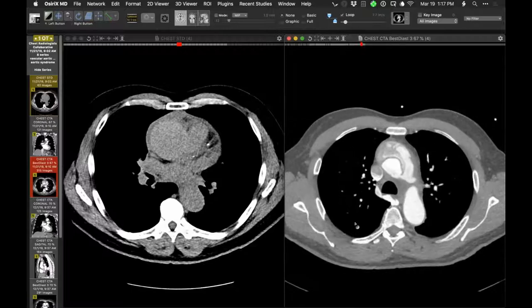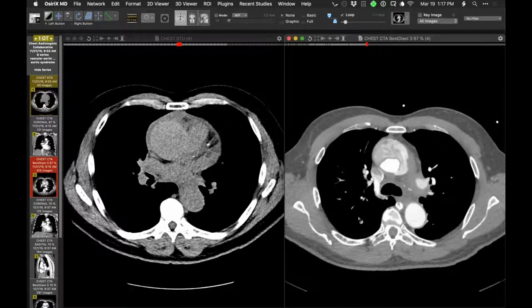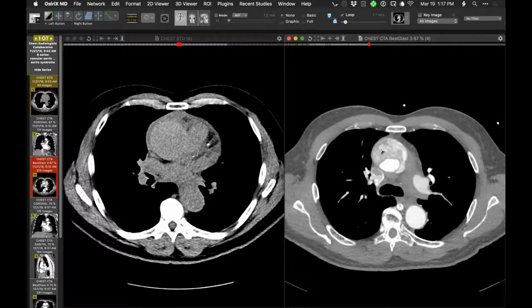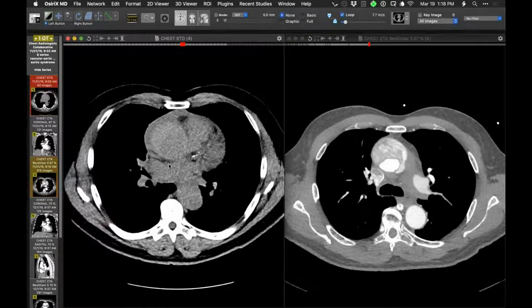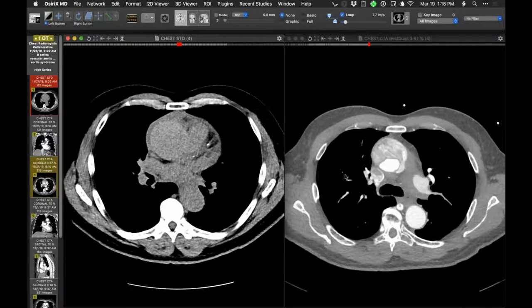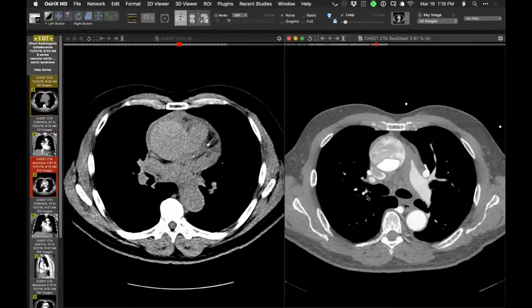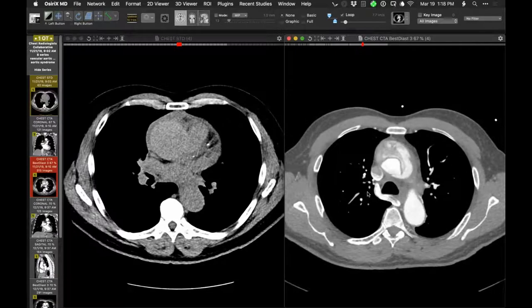So we see contrast medium leaving the true lumen, and we see that right there going into the false lumen, and the contrast opacified blood then going backwards. And of course, if we waited long enough, we'd see more and more contrast in relation to this right here, which is that hyperattenuating intramural component.